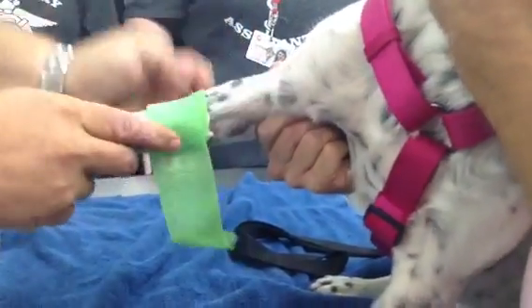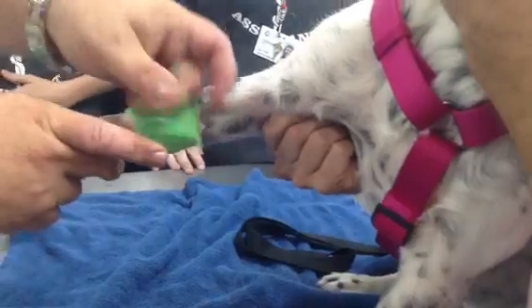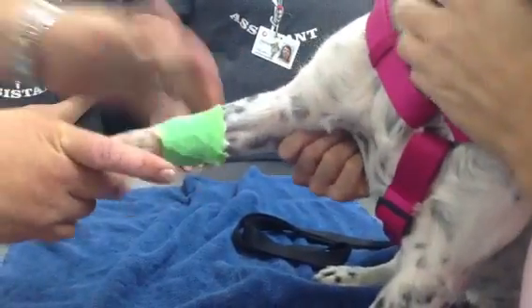Then put a bandage over — you're going to keep that there for about an hour. Small, very small amounts of pressure. And that's it.